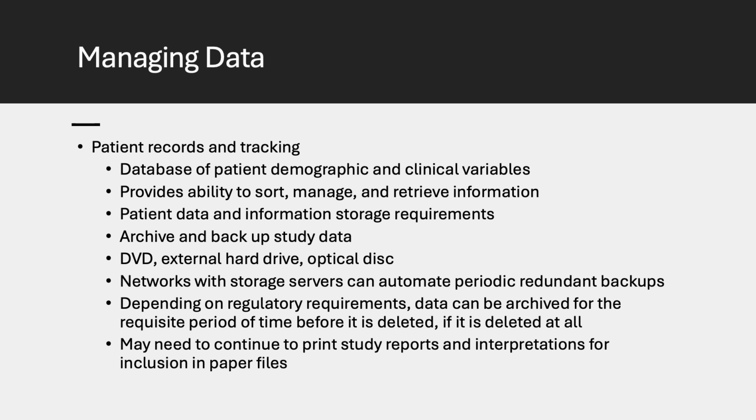There are many ways to store data. It's a good idea after a while to take the data from the hard drives and put them on physical media like magnetic tape, external drives, DVDs, or something like that. Nowadays, with cloud applications, we can back up and archive studies all online without physical media needed. However, if the cloud is down, you have no access to any of your data. Data has to be saved for years in some cases. Depending on the patient volume in your lab, you may have a third-party storage company that deals with your overflow.